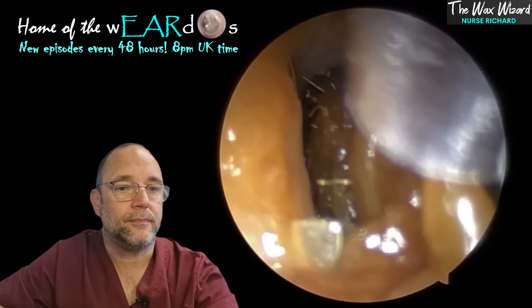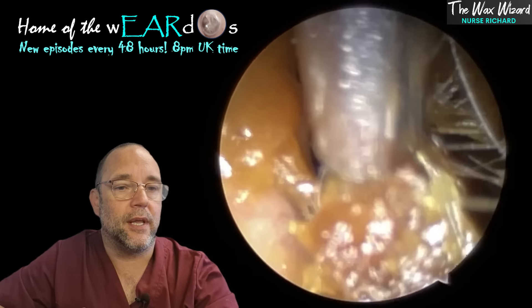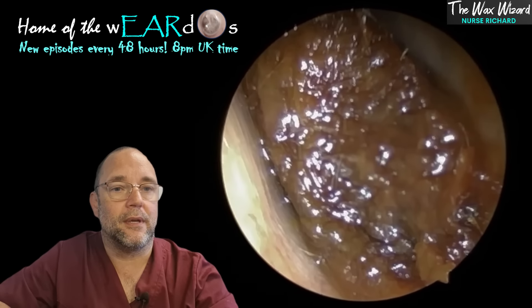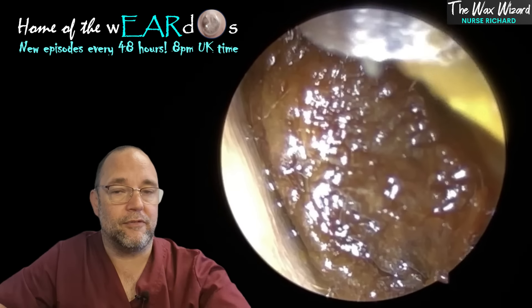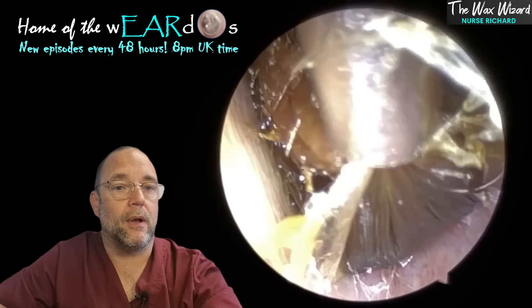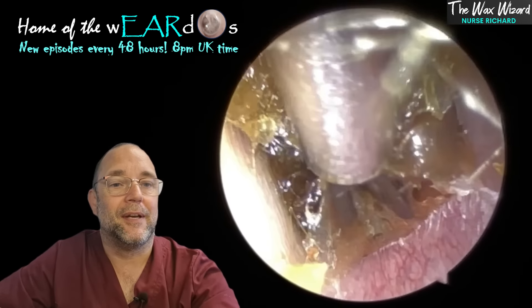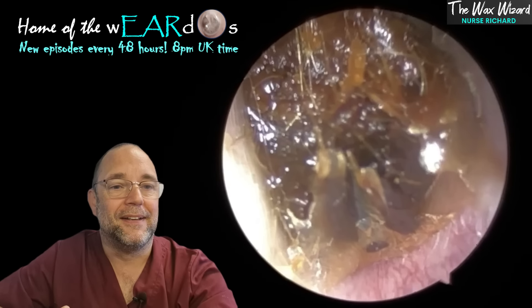The last one was a relatively straightforward case — just a chap who came to see me who couldn't hear much at all. He had quite soft wax on the outside, so I'll just get rid of that first, and then I can work my way inside the ear. It peels away quite nicely. Can you see the layers of skin there? You can see the little lines underneath it. It's kind of like when you chop down a tree and you get the rings — as things have aged you get the same thing here when the skin is migrating from the top layer of the eardrum all the way up the ear canal. You can see the lines staggered in there.